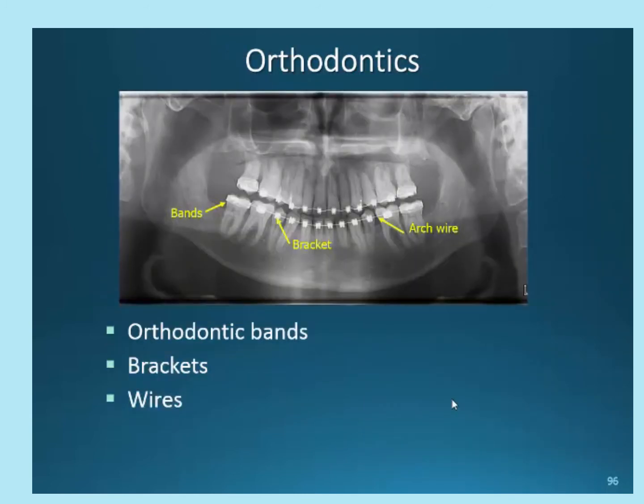Orthodontics, brackets, and wires. A lot of going on with metal when we deal with orthodontics and taking radiographs. This is a beautiful Panorex, and I've identified the arch wire, the bracket, and the bands.